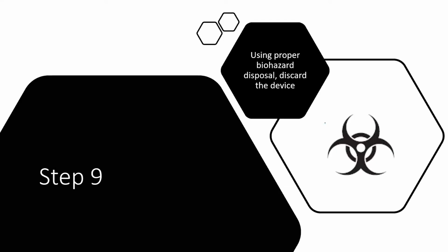Remember that this is a biohazardous material. Even though they come in a lyophilized form, it has the potential to cause disease anyway. So these should not be opened outside of a lab that has the ability to deal with biohazardous material.